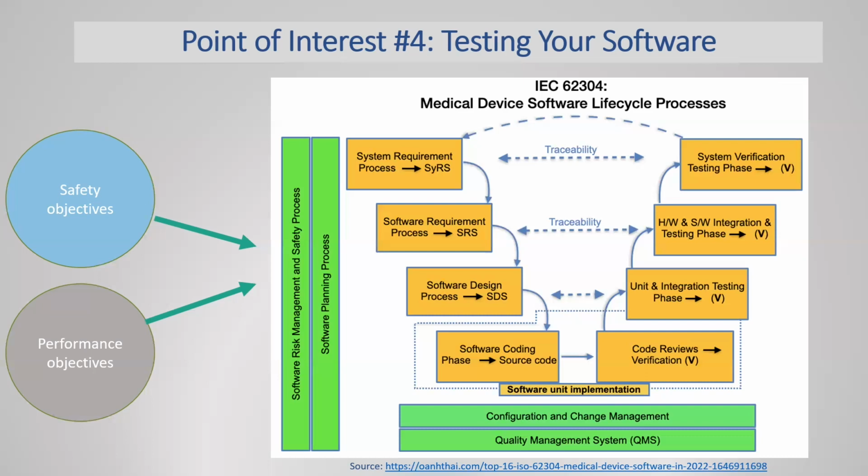And as far as performance objectives are concerned, it is best to isolate measurable performance outcomes as they relate to the software functions themselves, not to the whole device or to the device systems, but to the functions that the actual software performs.